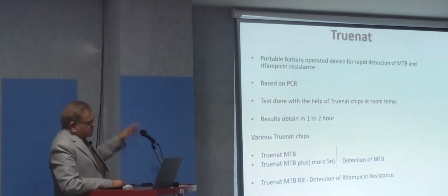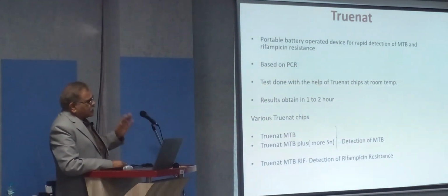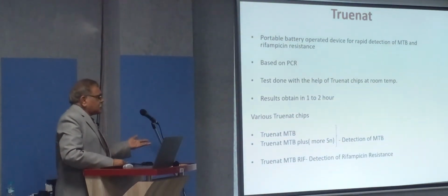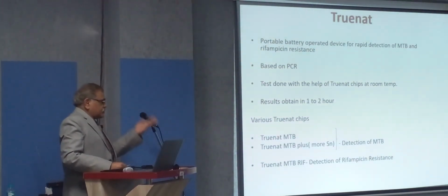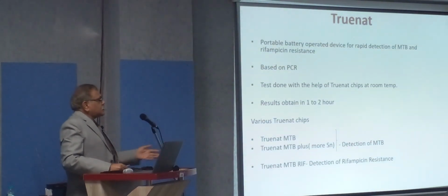These all, CBNAAT, TrueNat or LPA, line probe assay, are PCR based. Initially the PCR is done, and duplicate copies of DNA are made.